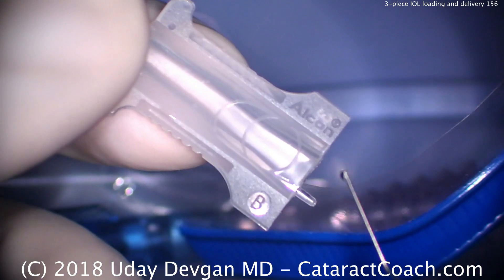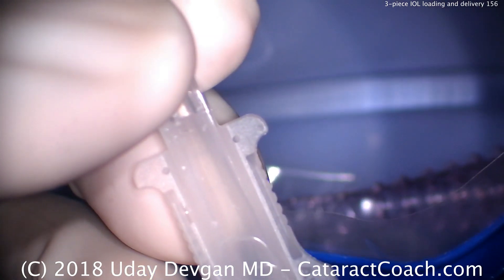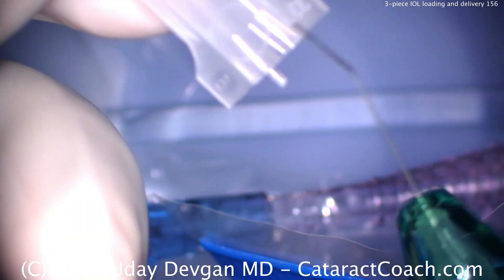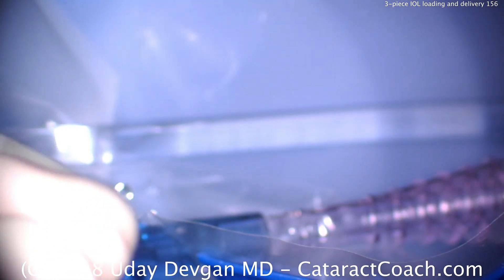There's the lens in the anti-S configuration, which is correct. We need to get our cartridge — we're going to use a B cartridge. This is the cartridge that has a little peg there on the end, which I'll show you. We fill the cartridge with viscoelastic. I tend to prefer the dispersive; I put a little cohesive there at the end because we ran out.